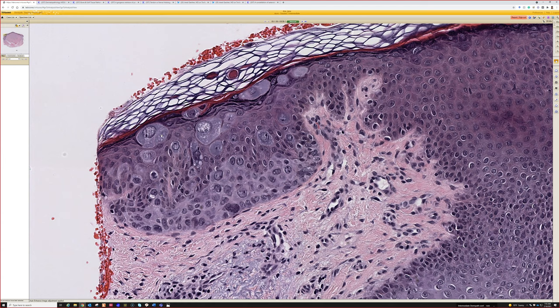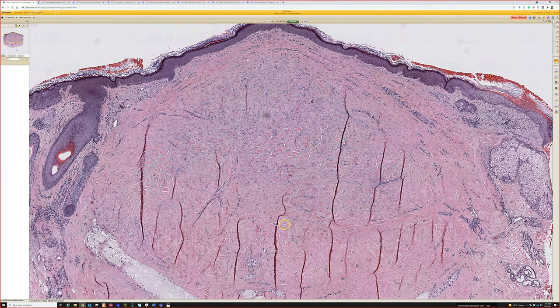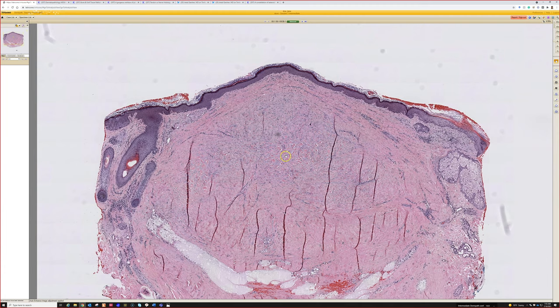I don't know the history of this case. But for practical purposes, the blue-gray cytoplasm there is good for epidermodysplasia verruciformis. This slide is in the study set as a keloid with triamcinolone steroid injection, but I thought it was interesting that there are a couple of little background findings.